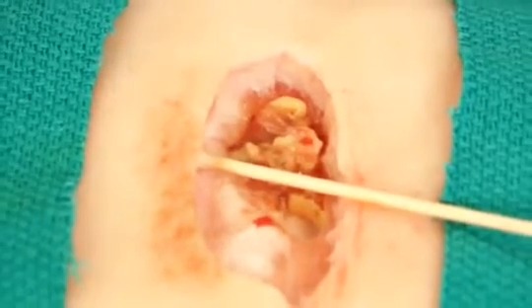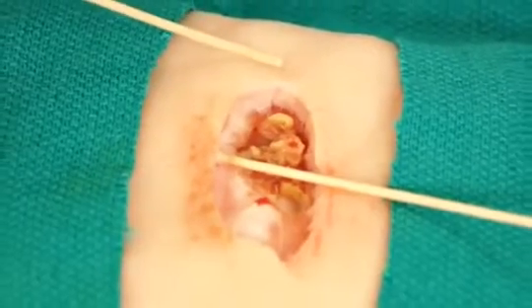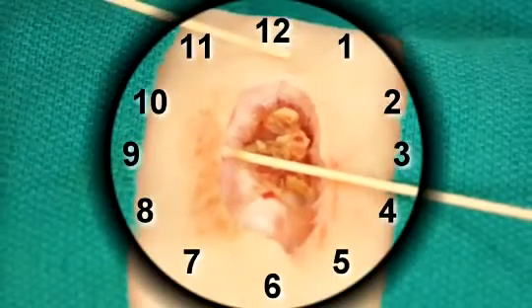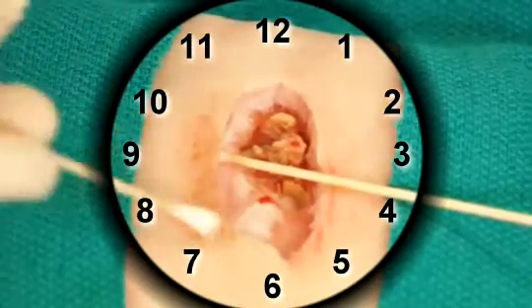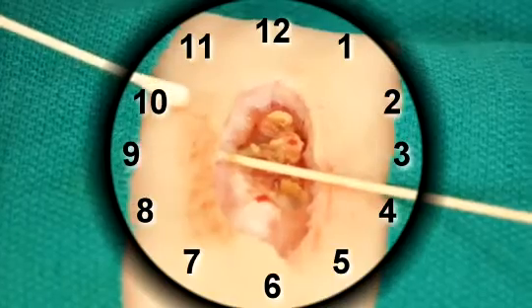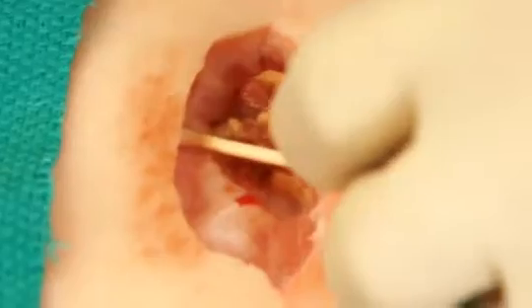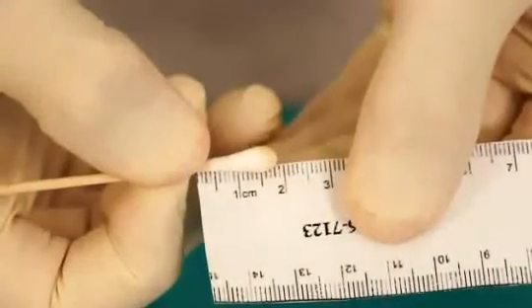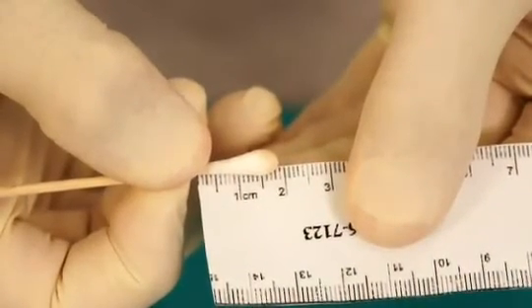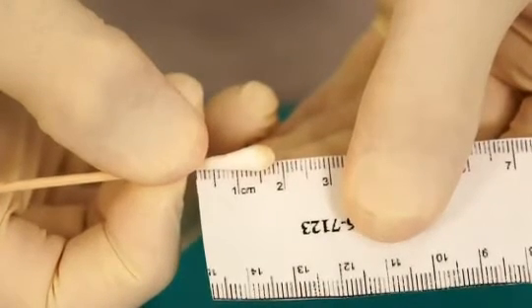As you can see, by convention, the superior aspect of the wound, or the head aspect of the wound, would be 12 o'clock. If we then progress clockwise around a clock face, the area of maximum undermining is approximately 10 o'clock. Similar to how we measured the depth of the wound, you would want to slide your finger down the cotton-tipped applicator, pinch it with your nail, and then bring it up to your measuring device. In this particular instance, it appears that the undermining is approximately 1.7 centimeters.